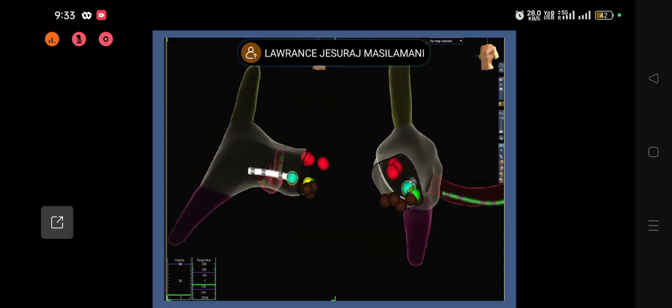You have a CS os. You can see in the RAO projection, the CS os is seen posteriorly. I have moved a little ahead of the CS os on the tricuspid annulus, and you see in the LAO projection I am facing septally towards the CS os. So this is the location where you are going to ablate the AV nodal reentrant arrhythmias.